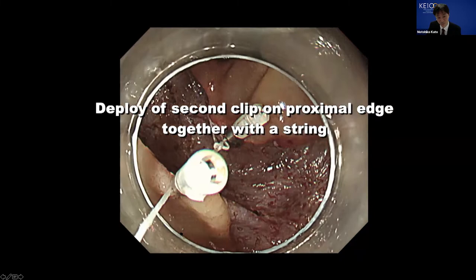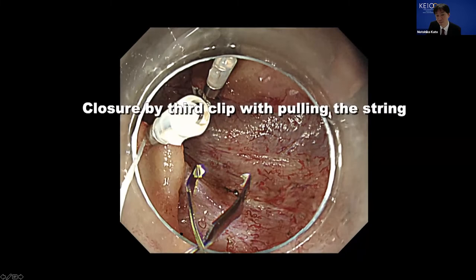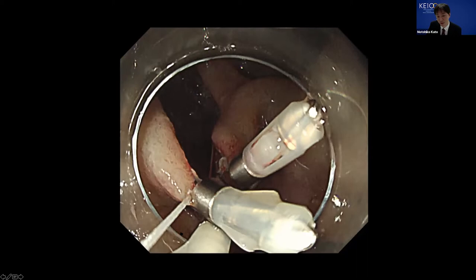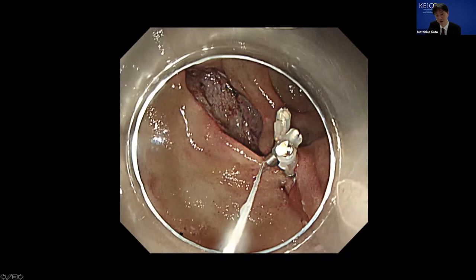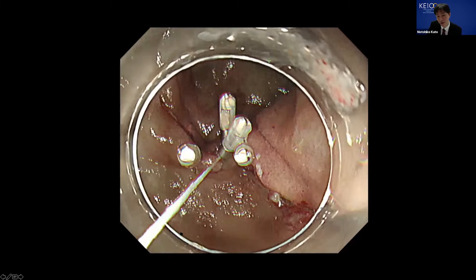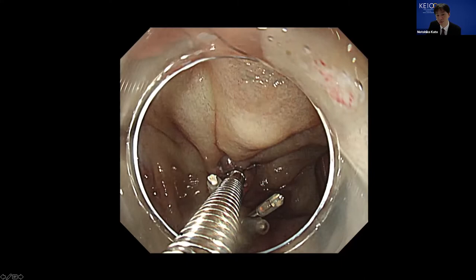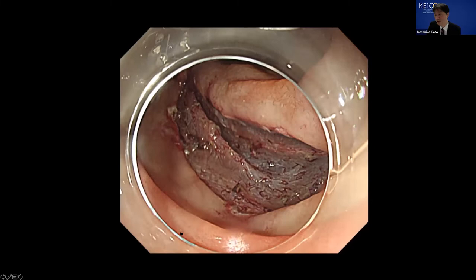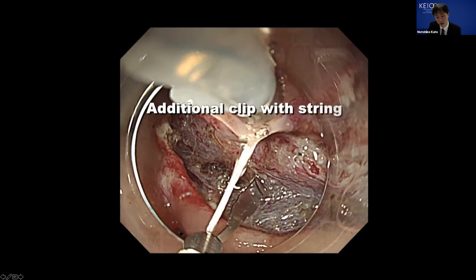This is important to approximate the large mucosal defect securely. A second clip is anchored on the opposite side. After that, a third clip anchors the edge of the mucosal defect by capturing the edge using the string. Then the mucosal defect is approximated, and an additional clip is deployed. By pulling the sling, you can change the direction of the endoscope, which is useful when it is difficult to approach the target from a tangential approach.